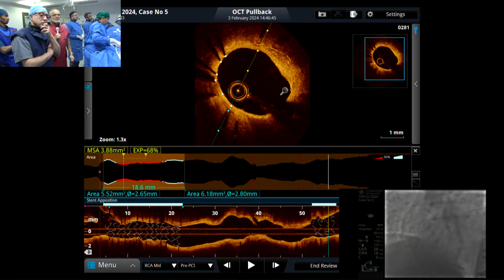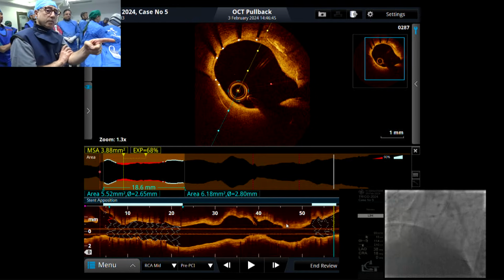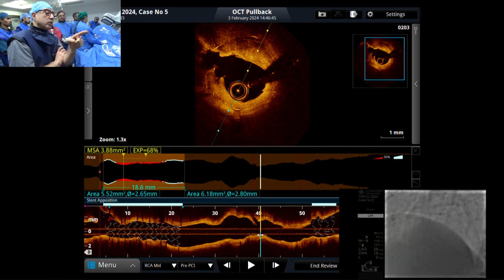We can get whichever size of Wolverine you want. Distal to the stent. What is the size? A clean landing zone.